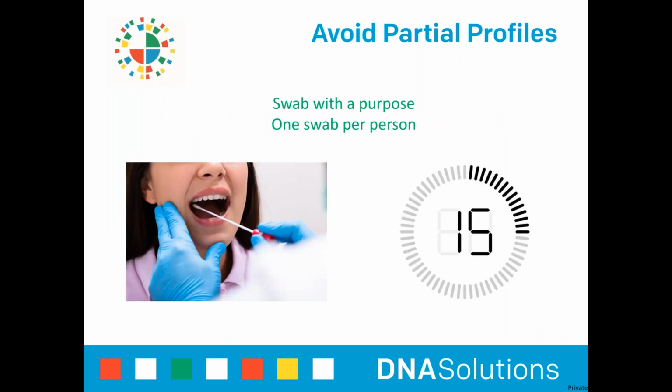When collecting a participant, open the swab sleeve as indicated on the packaging, remove the swab, and insert the side containing the polyester tip into their mouth. Press the swab into the side of the cheek and intently rub in a circular motion, using the entire tip of the swab to collect the sample. Your goal is to collect shedding skin cells from the inside of the cheek, not to saturate the swab with saliva. Collection should be performed for a minimum of 15 seconds per cheek.